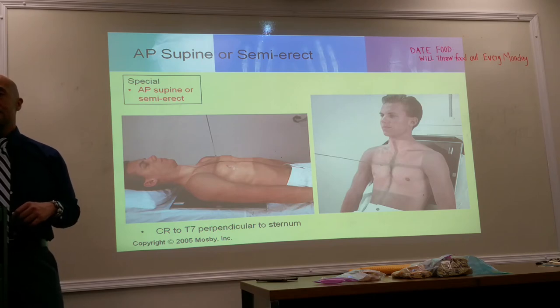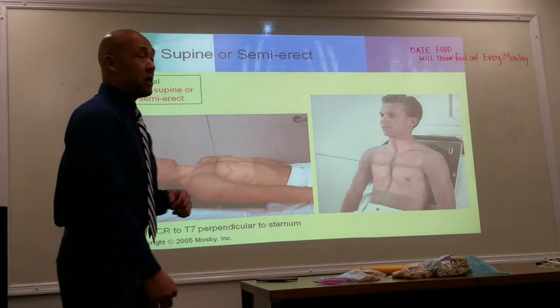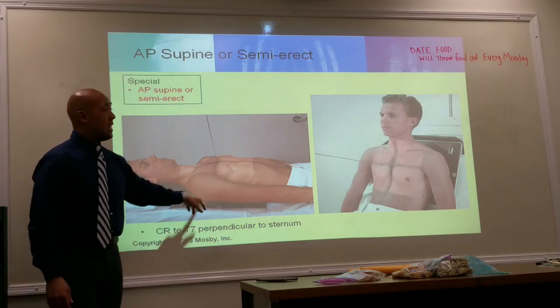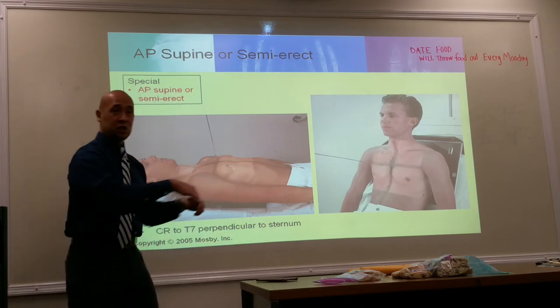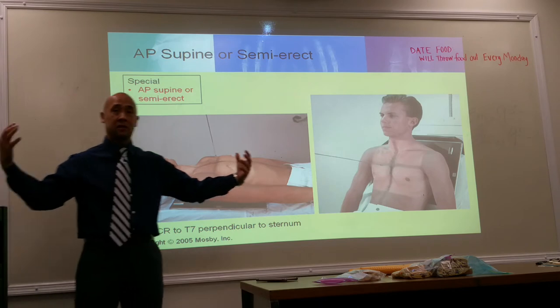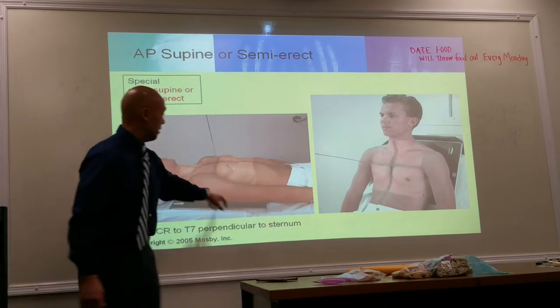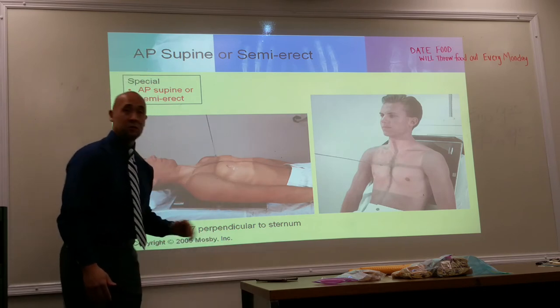All right. And you're saying for these, most likely we won't get 72 inches, right? Yeah, you're not gonna be able to get 72 inches. Now, especially if you're doing supine like this. So this may have to lower our technical factor. At least with this you can, because you can just bring your portable back, just roll it back until you get that max distance of at least 60 inches. But if they're laying down like this, your tube can only go so high. And the bed can only go so low.